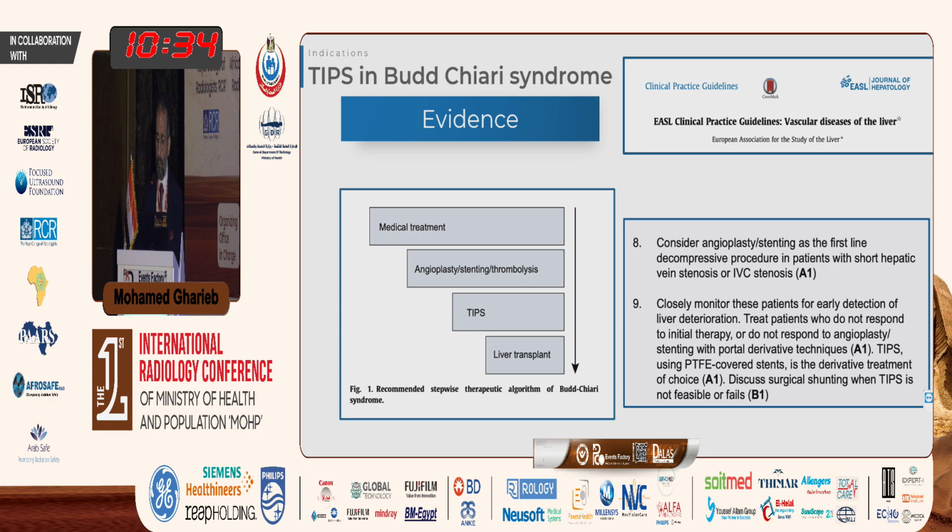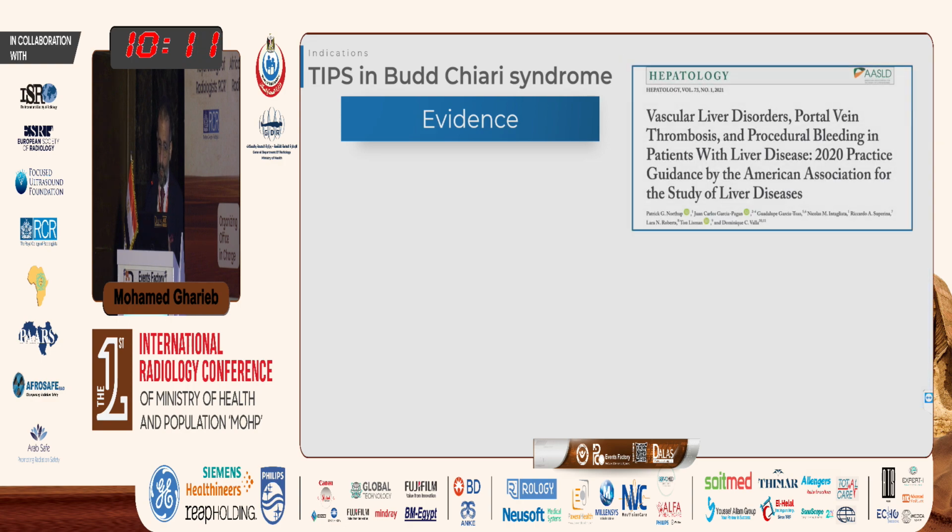And TIPS is a definitive treatment of patients with Budd Chiari. It's not only a salvage therapy or transient therapy. No, it can be a definite treatment of Budd Chiari disease. And we have patients from 2005 till now alive and well and doing good with excellent liver function and having TIPS patent along these years.